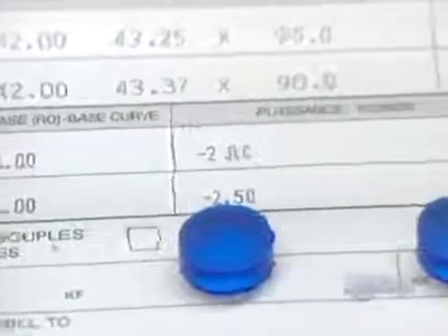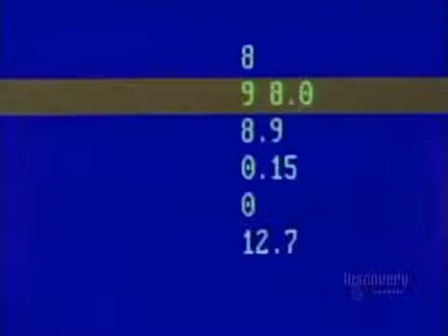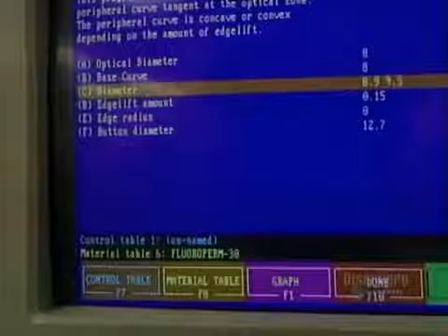We see here a patient's prescription, essential to the fabrication of lenses. The process begins with data processing control of the shaping. Data is supplied by computer, which controls a digital lathe.